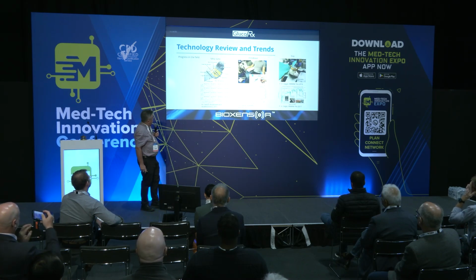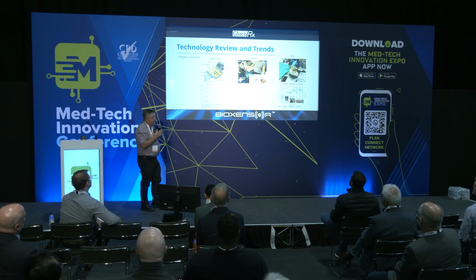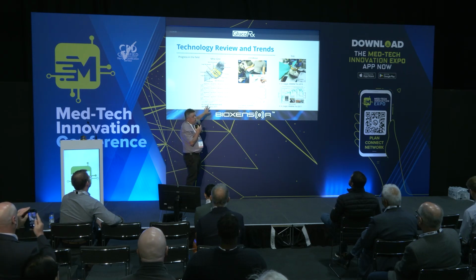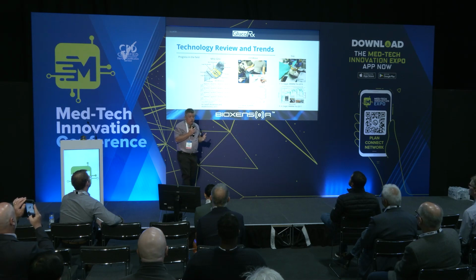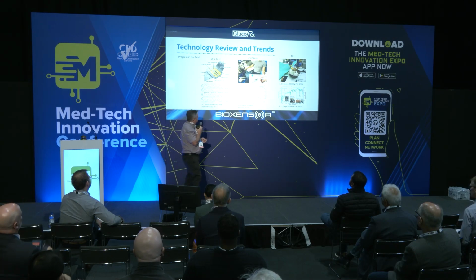Well, these are the electromagnetic type sensors that have been developed over the last couple of decades. Some of them are watch-like. This one works at RF frequencies, radio frequencies. And what you see there, this is published data, you see trends which track blood glucose. I think these were done in comparison with some blood prick tests at the same time.